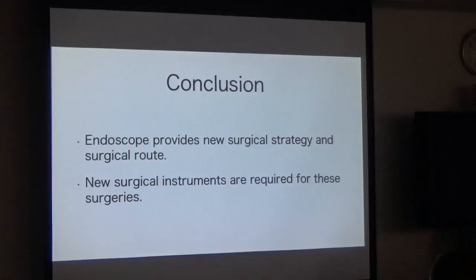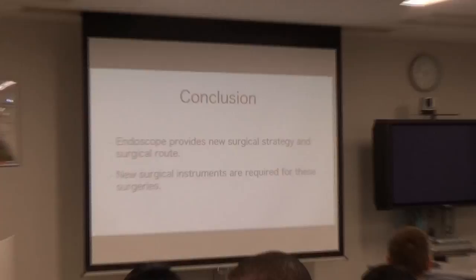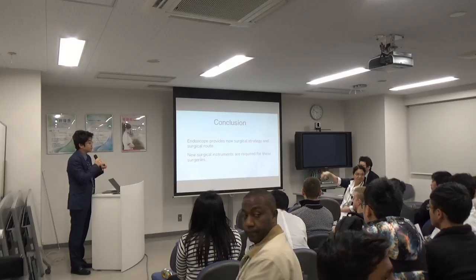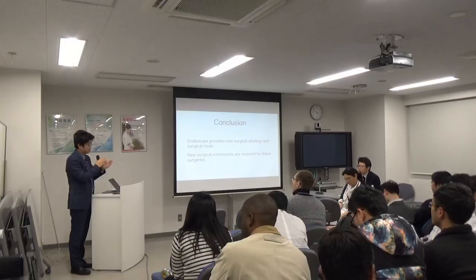Thank you very much. Excellent technique. Excuse me, if you have a massive hemorrhage during the procedure, how do you manage it? Because you can use only one instrument. Oh, of course, I can use two instruments, even in the 6 millimeter diameter. It's possible. And if the wet field is used, the hemorrhage is easy to stop because of the water pressure. Water pressure. Yeah.